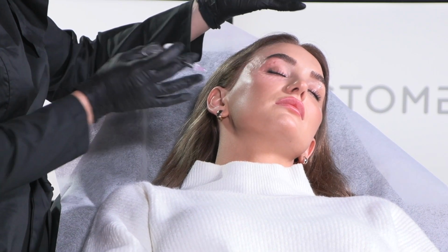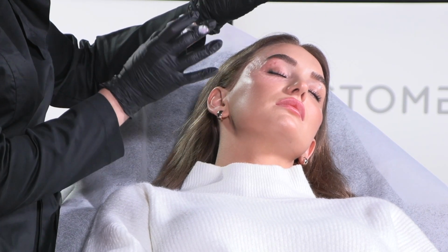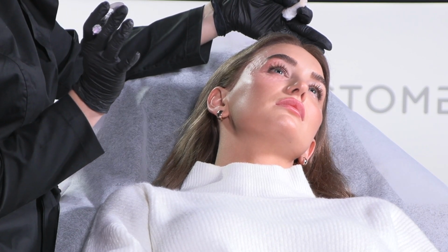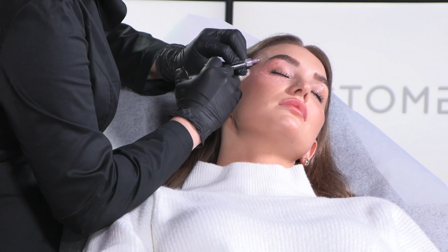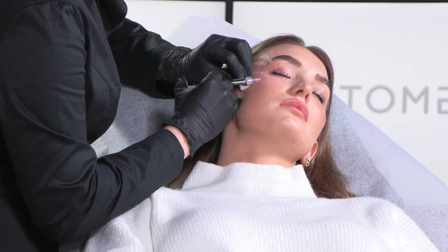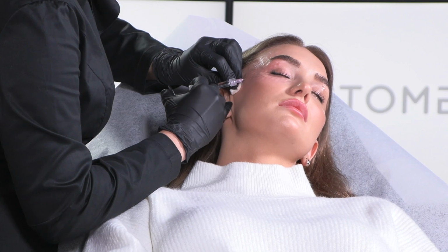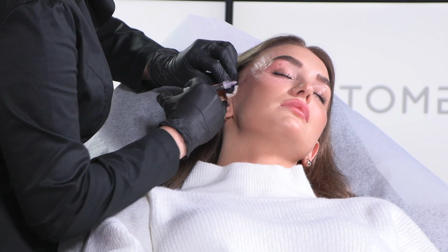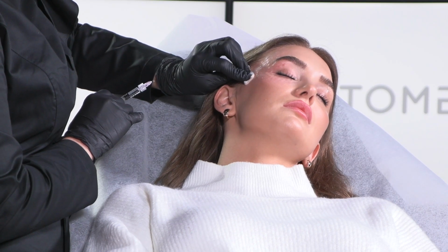And after the treatment, unfortunately, our patient now has a lot of makeup. But even when I inject the eye area, I apply a Jalupro mask after, for all the face and eye area as well. When it's not a demonstration, of course, you can wash the face of your patient and just apply the mask after. The mask helps to pull the papules back into the skin, which is very good, and rehabilitation is way better and faster. So we injected 0.5 now. I will press a bit.